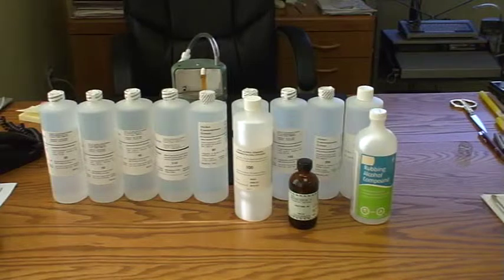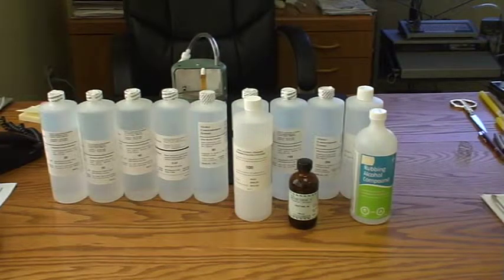And there's no reason why you couldn't have an ethanol acetone combination in a simulator, and there's no reason why you couldn't have an isopropanol ethanol solution in a simulator, or a combination of acetone, isopropanol, and ethanol for purposes of testing.